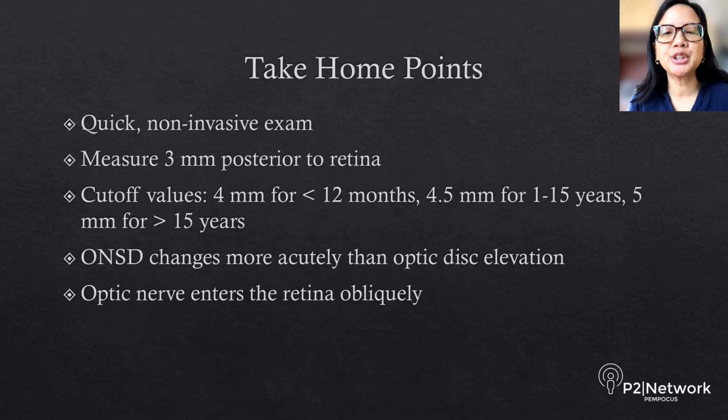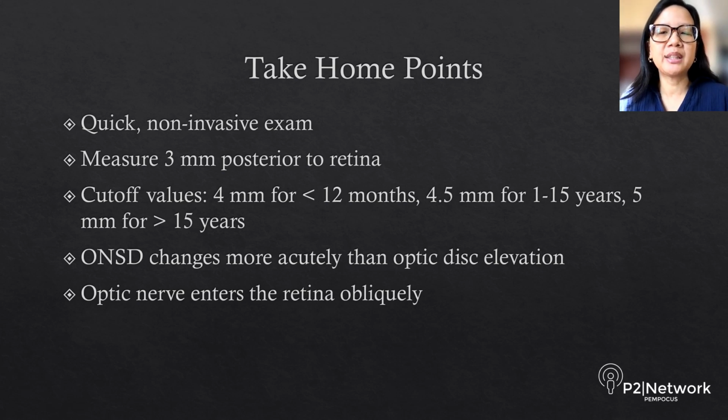Take-home points from this lecture are that optic nerve sheath diameter measured using point-of-care ultrasound is a quick, non-invasive exam that can be done at the patient's bedside and can be really useful in helping you figure out which of these patients needs an expedited workup. You want to measure optic nerve sheath diameter 3 millimeters posterior to the retina. And remember that especially in children, the optic nerve can enter the retina obliquely, and you want to measure diameter perpendicular to the true long axis of the nerve.